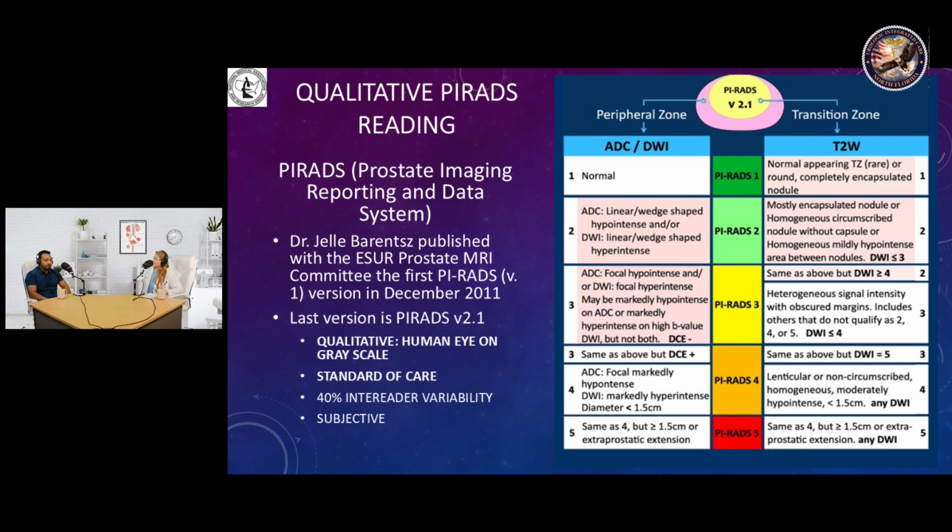That's great. And this has become the standard of care as well, how to assign PI-RADS by a board certified radiologist. Unfortunately, there have been many publications that demonstrate that there is not only intra-reader variability, but also inter-reader variability, and I think that's a limitation. Yeah, it means it's subjective. Basically, your human eyes look at the images and characterize them in grayscale. I mean, pre-coffee versus post-coffee, I don't know. Exactly. You might have some variability there, too. Exactly right. All right, next slide.